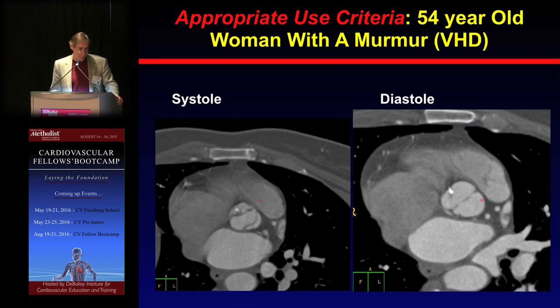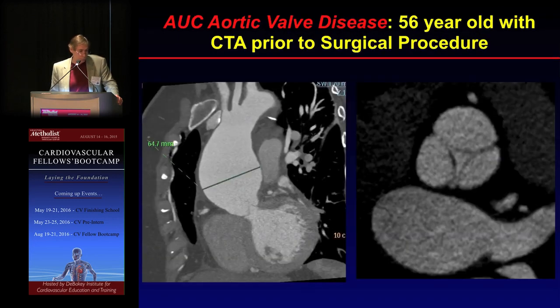This patient had no evidence of aortic regurgitation. The valve comes together nicely. This patient actually also had no evidence of stenosis. We can planimeter these valves and see what the valve area is. But you can see this is an abnormal valve. This is what a typical valve should look like. It should look like a tri-leaflet valve as shown here. You can see the difference between the bicuspid and a normal tricuspid valve.